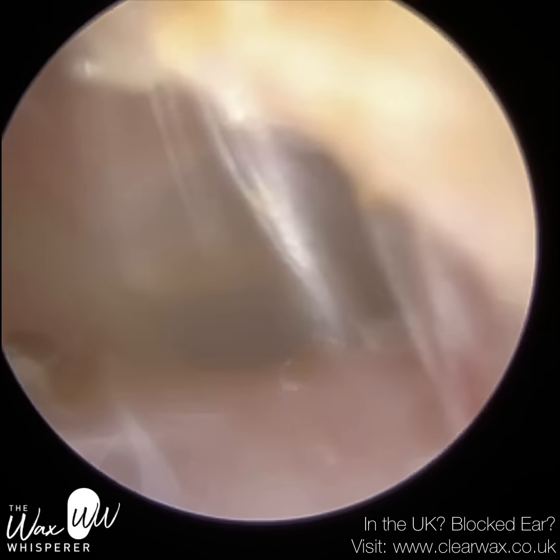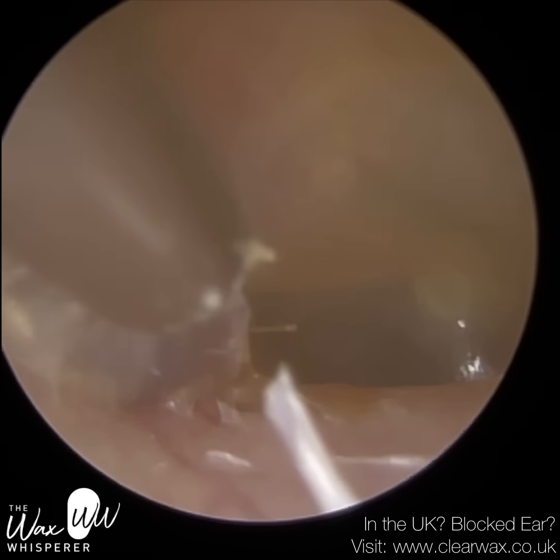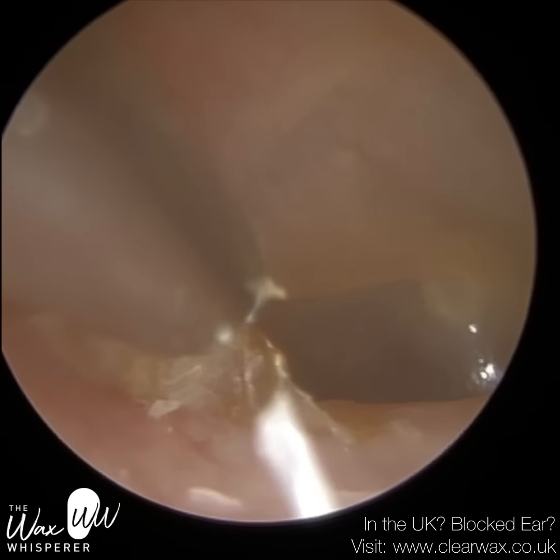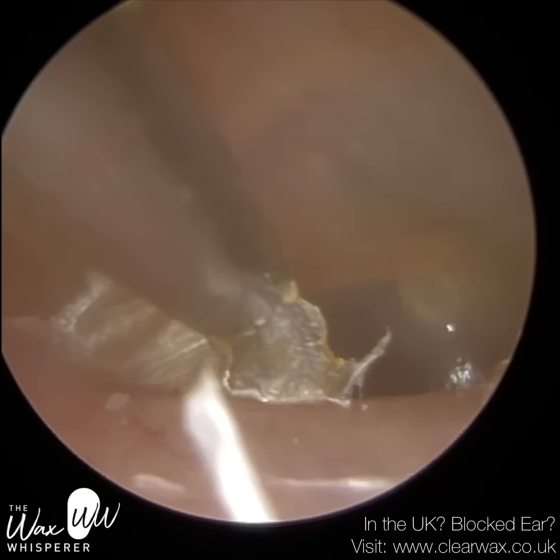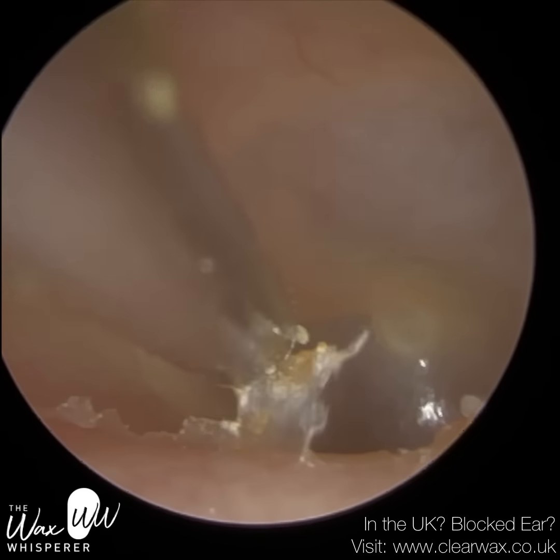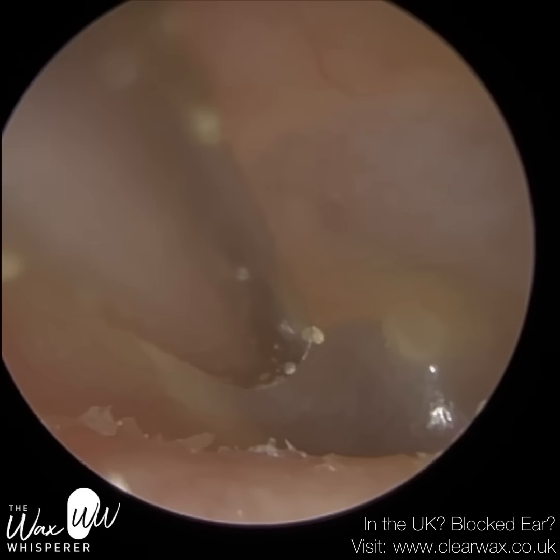The patient is aware that they suffer from chronic earwax and dead skin impaction and have to have their ears regularly cleaned. They know that what we're doing today won't stop this condition from reoccurring — they've been having their ears cleaned for many years. This is their first time visiting me. They had problems having their ears cleaned elsewhere — it's been quite uncomfortable and the occlusion difficult to remove. I can understand why, given how narrow the canal entrance is. They were recommended to see me by a friend with a similar problem, and we were pleased they did. They were able to hear a lot better upon leaving.